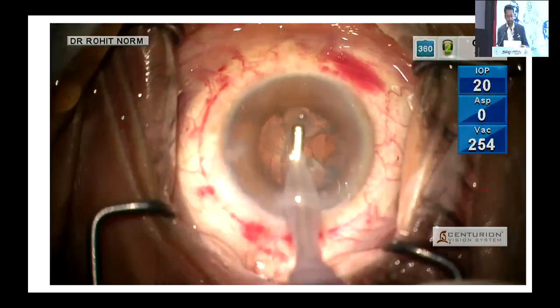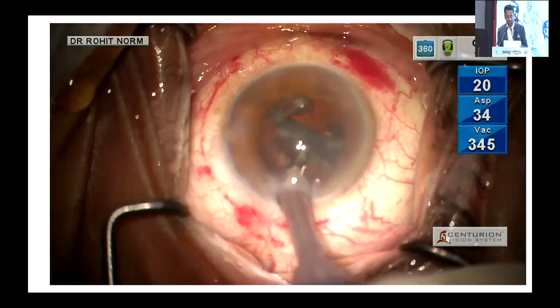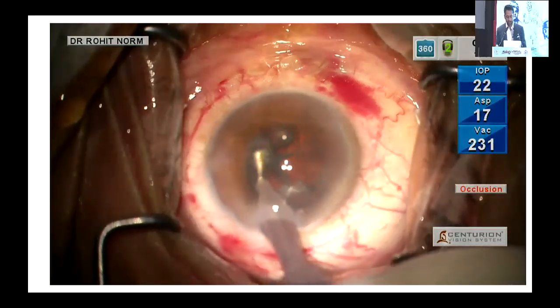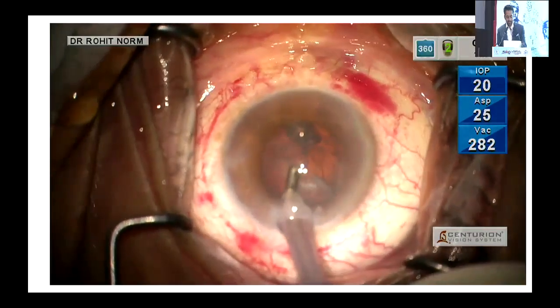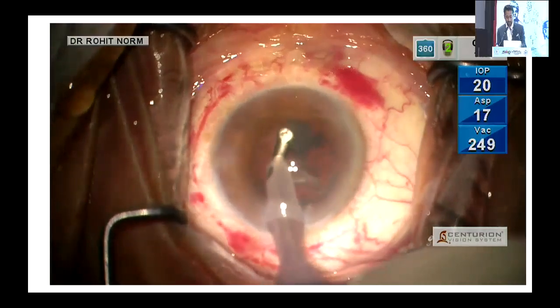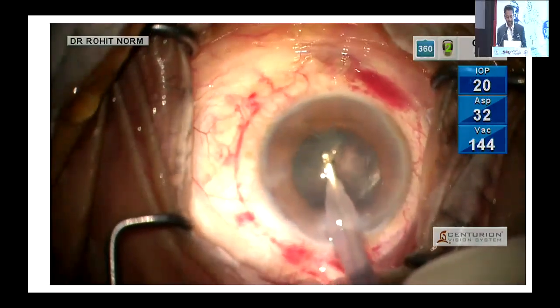Because of femto delineation, you have an epinuclear sheet which provides you a shield to the posterior capsule. So you can see for cortical aspiration, I have retracted my sleeve of the phaco probe because you can differentiate the level of irrigation and aspiration, simulating a bimanual IA.